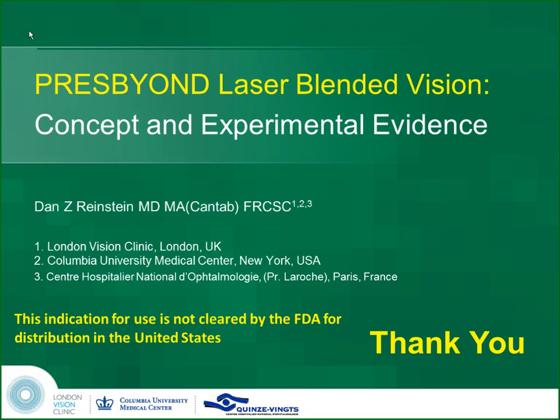0.56. Now, the number came from a 2004 publication of ours on night vision disturbances, where we noticed that when we did a wavefront guided treatment on patients, here it is, we found that these are the patients that had night vision problems and low contrast. We decreased their spherical aberration by 27%, but we increased their contrast sensitivity to normal, despite the fact that we had left them with spherical aberration.